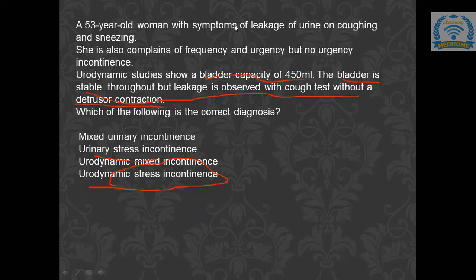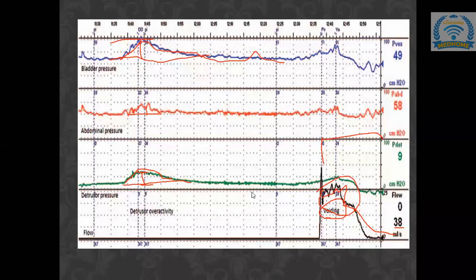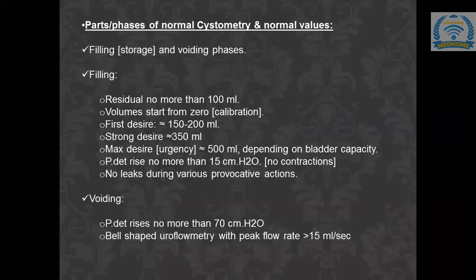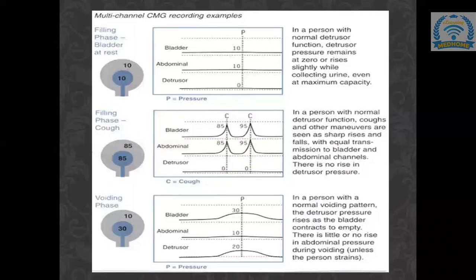The second half, the voiding part, has to do with other diagnoses like bladder outlet obstruction. That goes up to the level of the urologist, not for us.